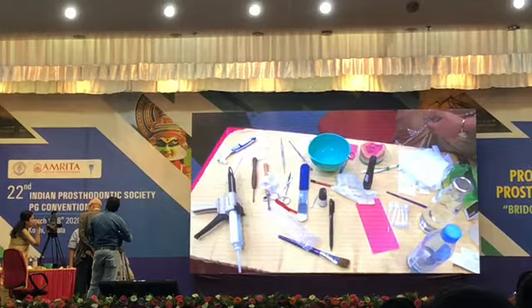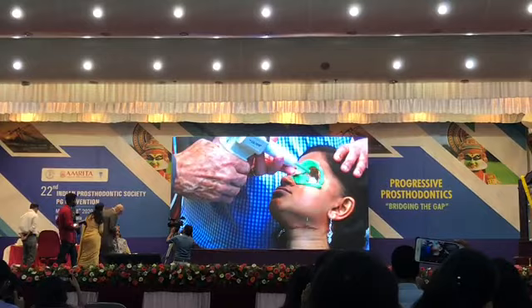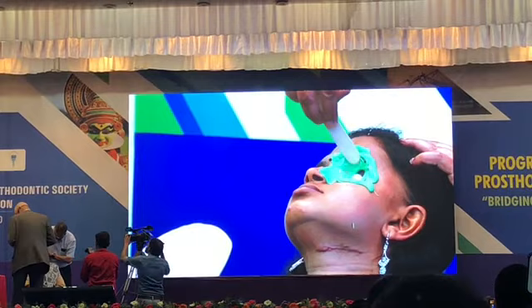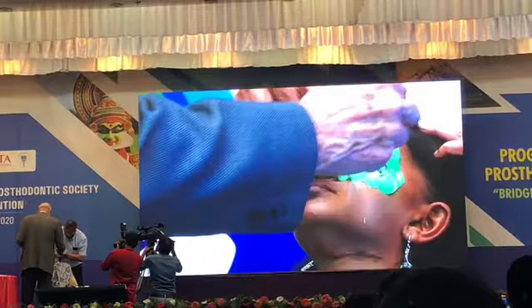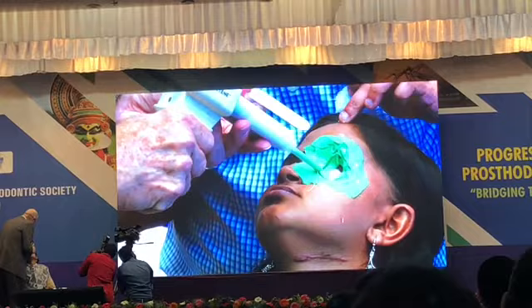Just go around like this. And thin it out with your tongue blade. And then we'll stick a little there. And thin it out. That should be enough. Where is it? Okay. A little bit light. Okay, that's enough. Right there, just right there.